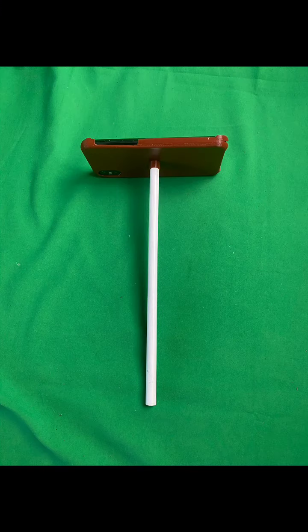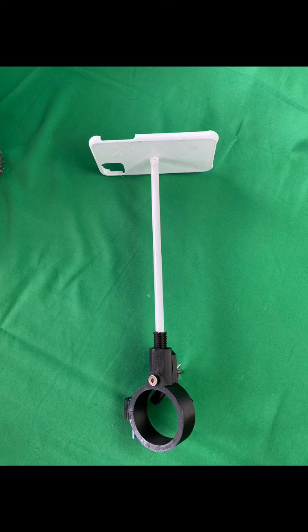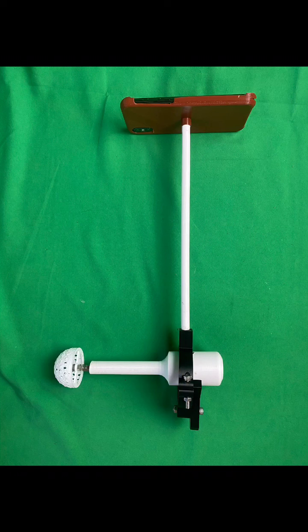A, case iPhone probe tool, CIPT. This device is dedicated for surface registration, and the same instrument combined with the next instrument, the clamp, works as a position detector. The tool consists of the case, in which the iPhone sits, and the rod. The rod has a predefined length and is attached perpendicular to the phone's case, at the point where the factory defined the centrum of the iPhone.